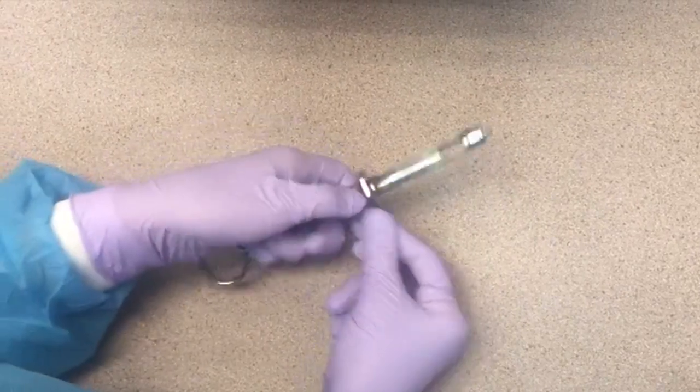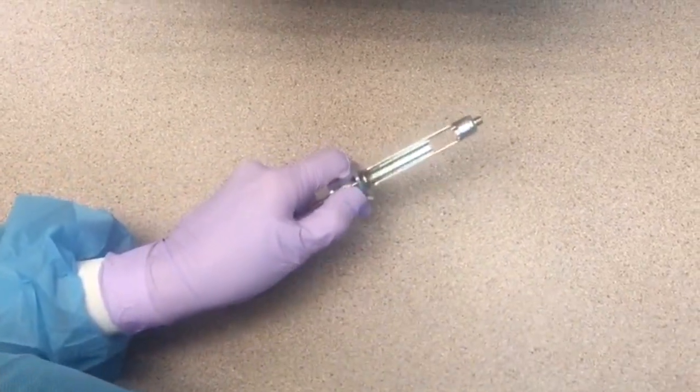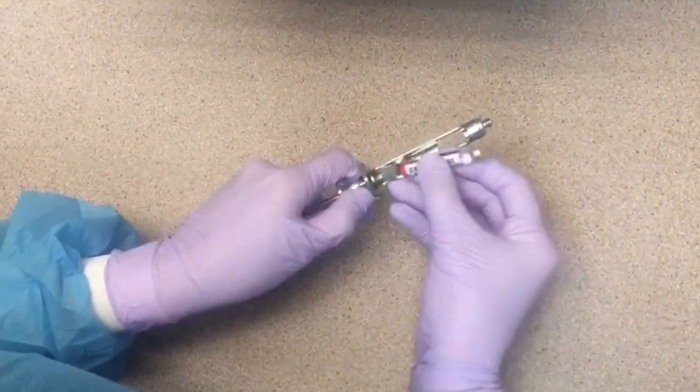Pull back on the thumb ring as far as it will go and insert the anesthetic cartridge plunger side down.